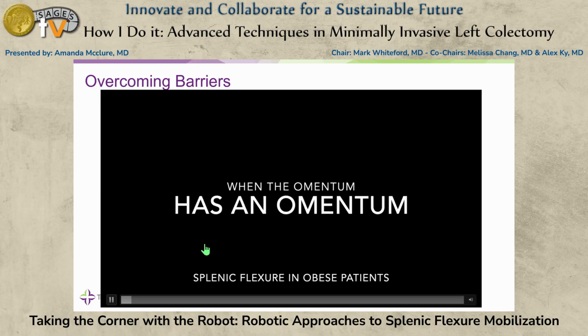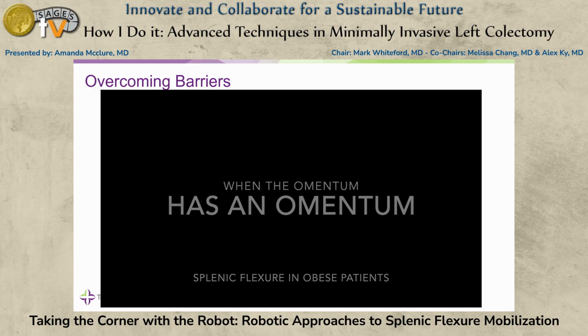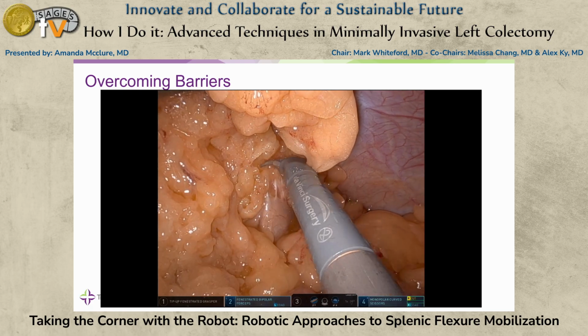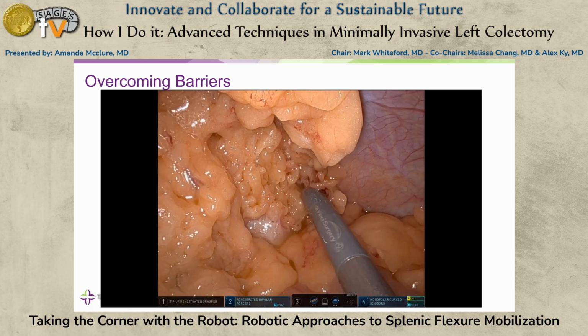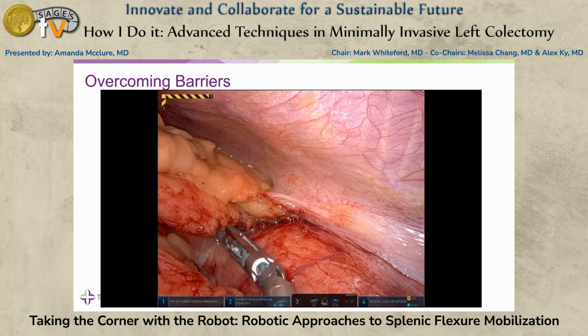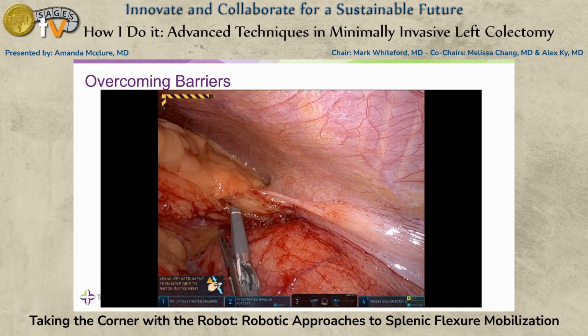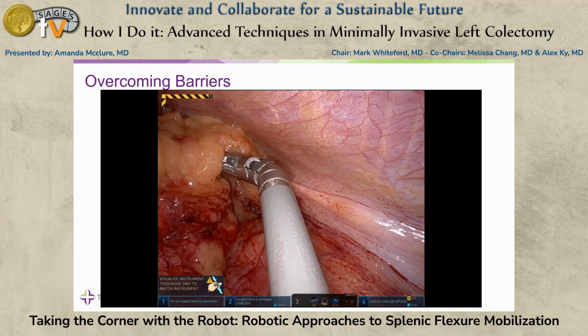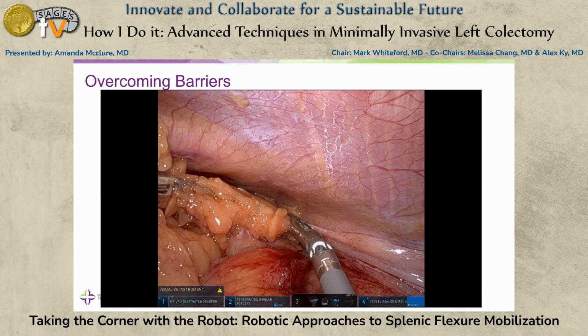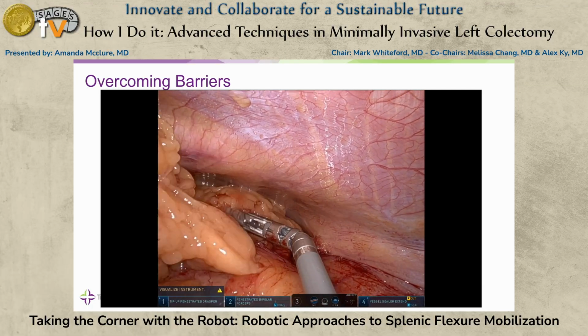So one of the other things is when the patient has a bulky omentum, so your BMI is 60. So again, like we talked about, just know that it's going to be a hard case. It's going to take time. And so really you just want to stick to the colon. If you know where the colon is, if you can find the colon somewhere, you can keep out of trouble. The medial and lateral planes are going to be the easiest, and likely because the omentum is so bulky, that anterior plane and the omentum is going to be the hardest.